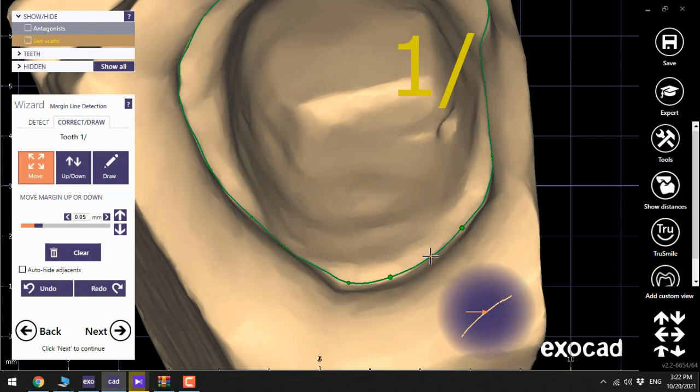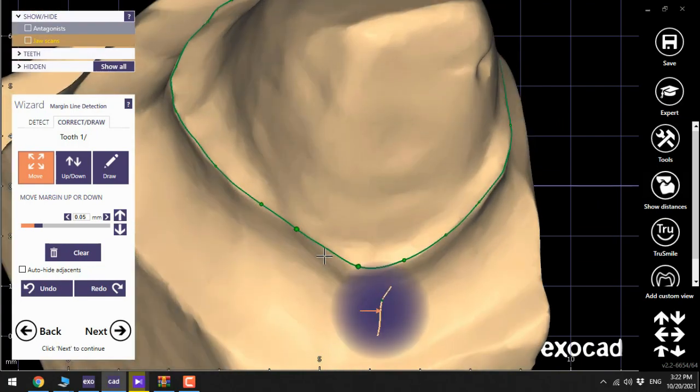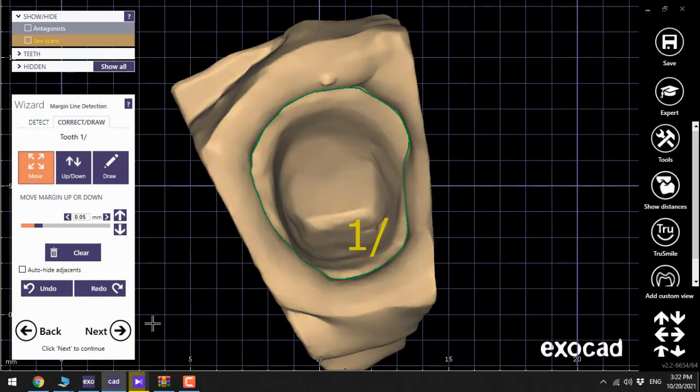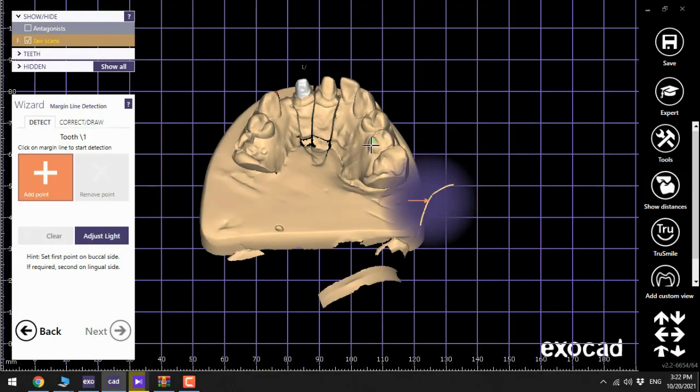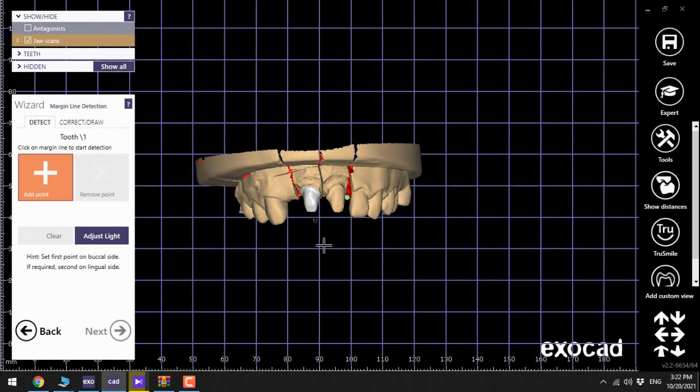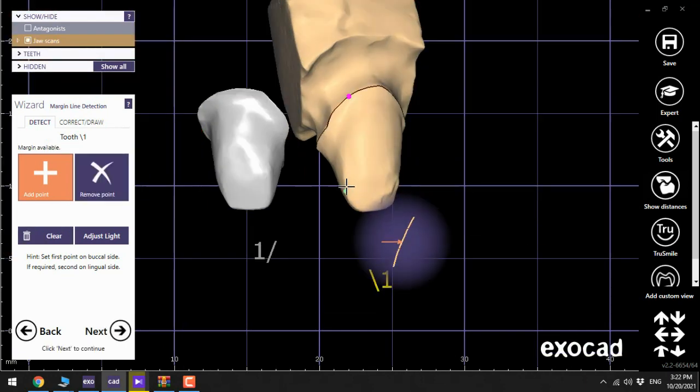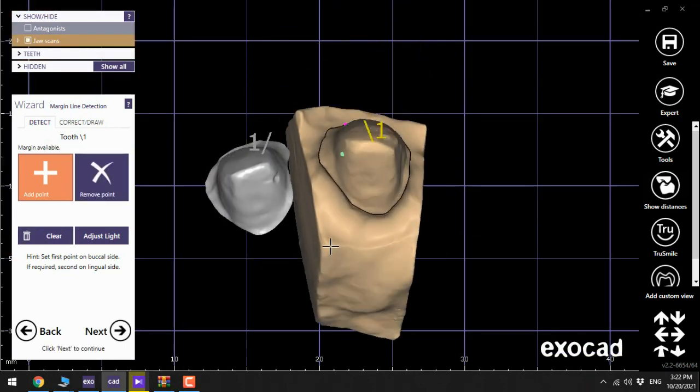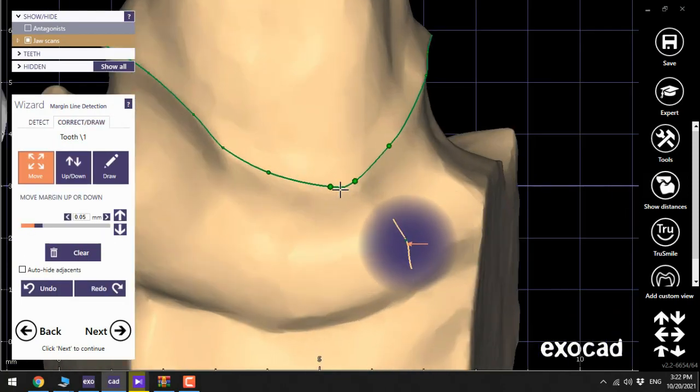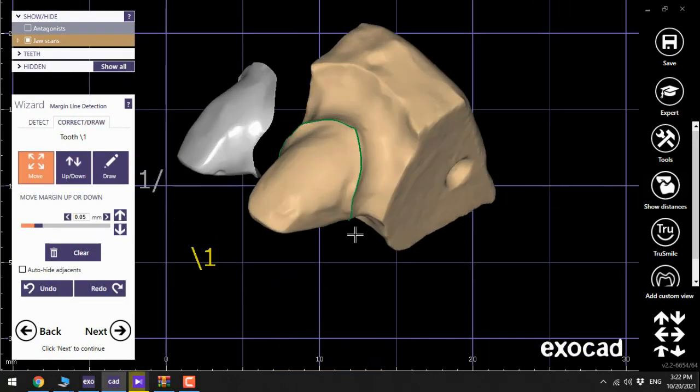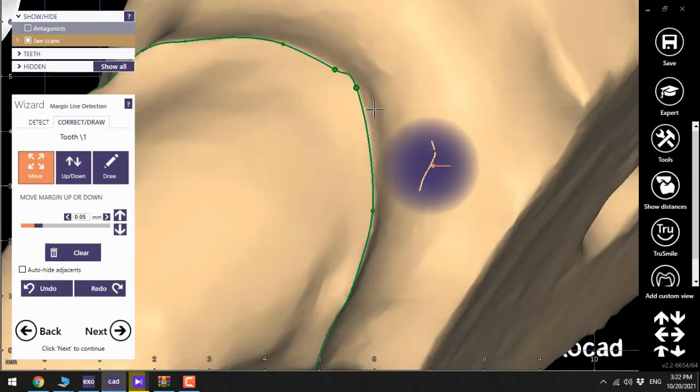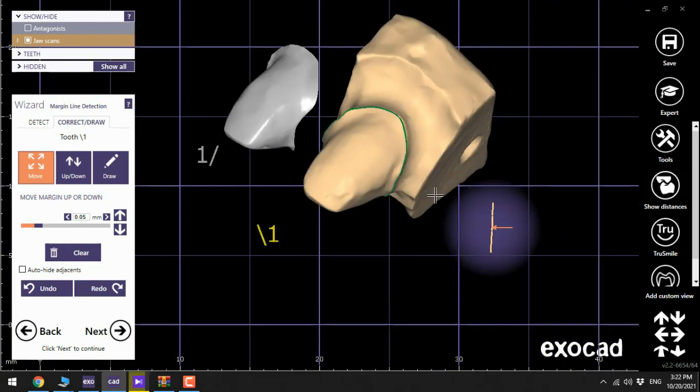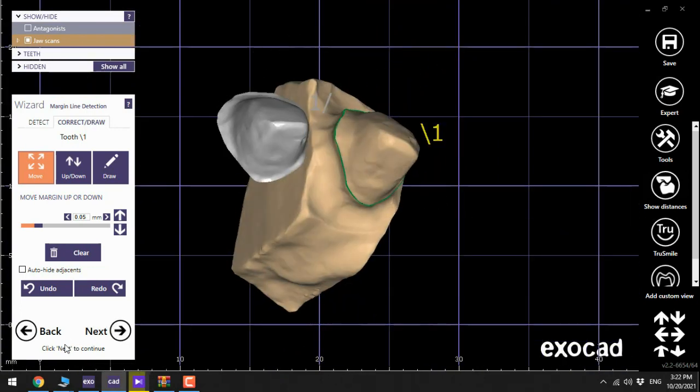First detect and then correct if needed. Next. Correct this point then also this part. Now looks good, next.